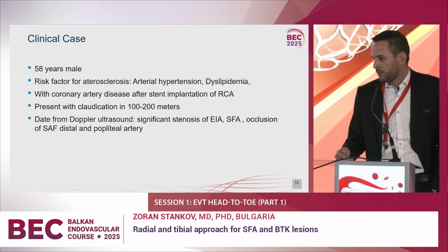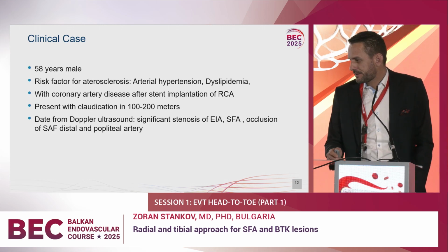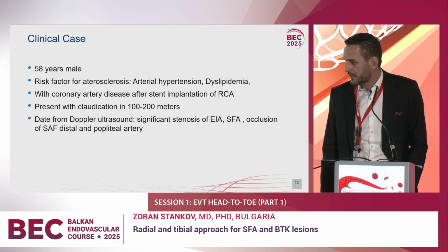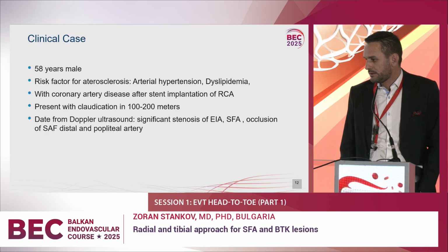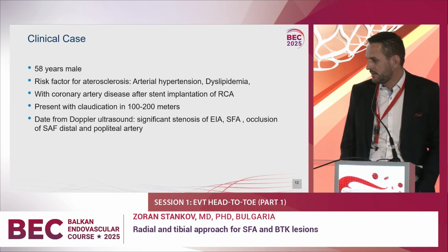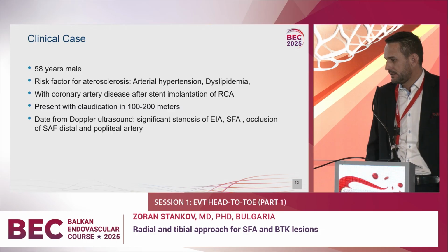Clinical case: I want to show one patient with risk factors for atherosclerosis, hypertension, dyslipidemia, with coronary artery disease after stent implantation of the right coronary artery, presenting with claudication at 100 to 200 meters. Data from Doppler ultrasound show significant stenosis of the external iliac artery and SFA, and occlusion of the distal part of the SFA and popliteal artery.